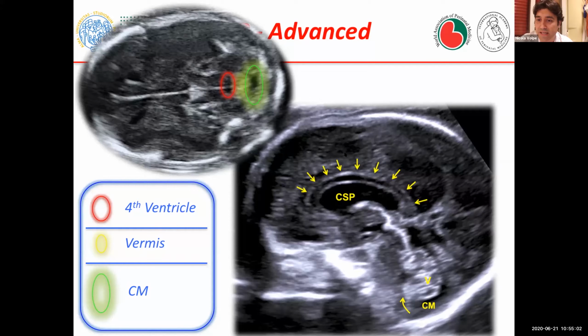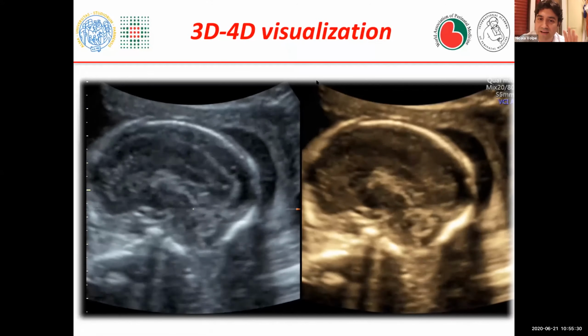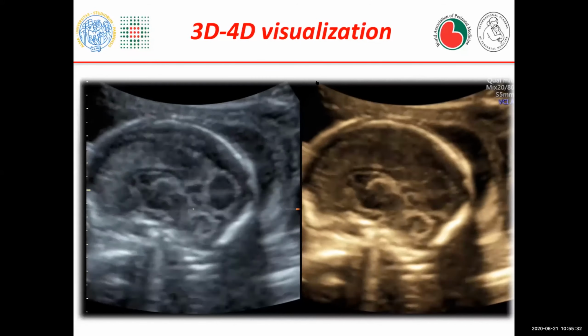And you can see here the mid-sagittal view where all this could be clearer for the majority of us. The fourth ventricle is just down here, usually almost virtual, and is this space here. The vermis has this shape in sagittal view, and then the cisterna magna is just behind. When you see these three spaces, usually you have enough confidence to say that it's okay.